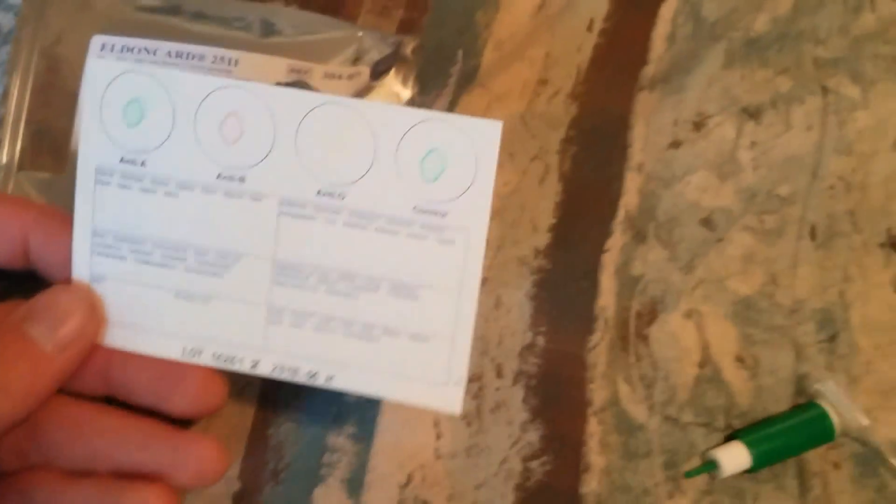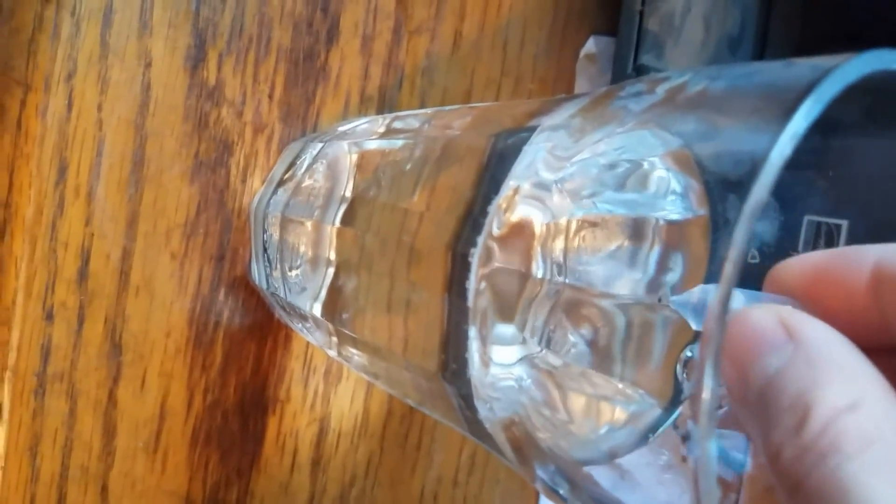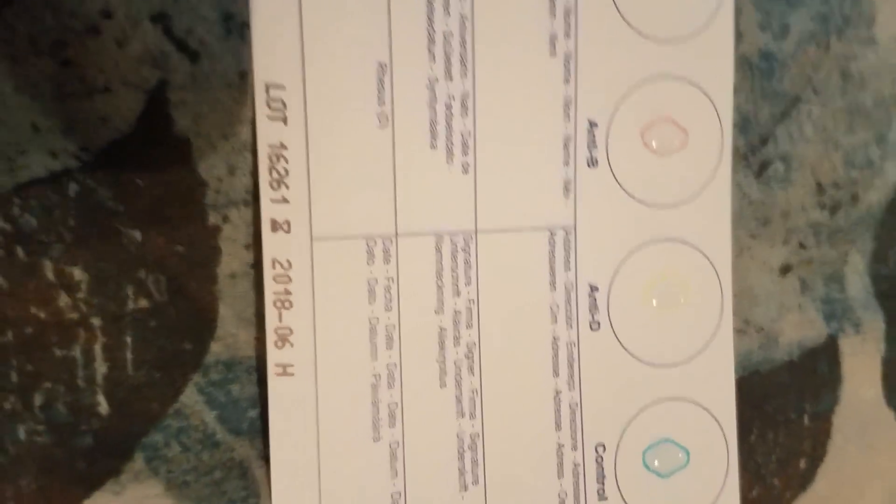Out of the package comes the Eldon card. I'm going to get some water in my dropper. Now I'm going to carefully put just one drop onto each of the blood type sections — one, two, three, four. Perfect.